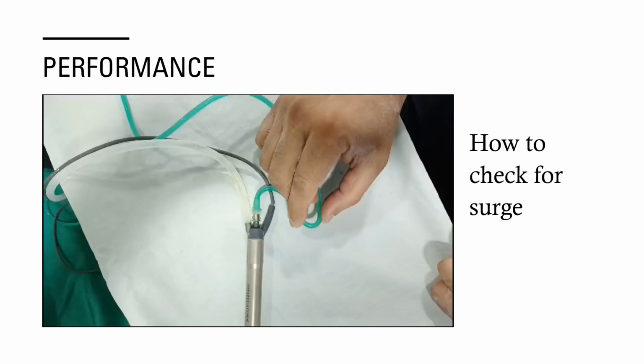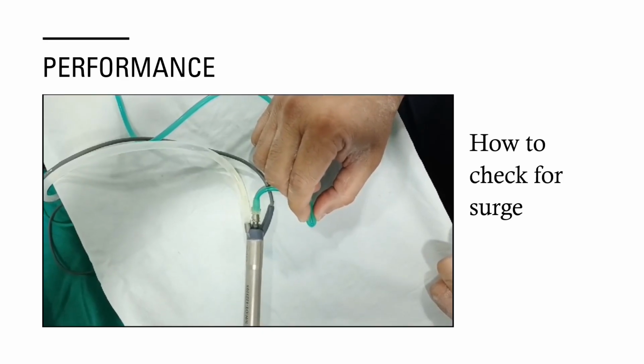So set up your machine and then place the handpiece at the level of the patient's eye where you used to have your OT table, and then press the foot switch, and start squeezing the aspiration line and releasing it.